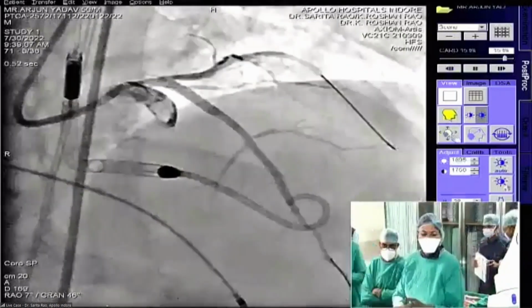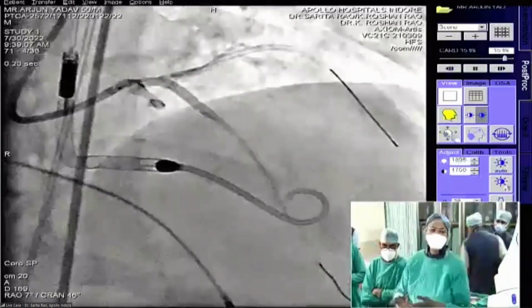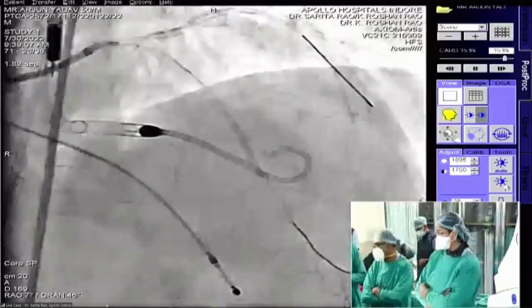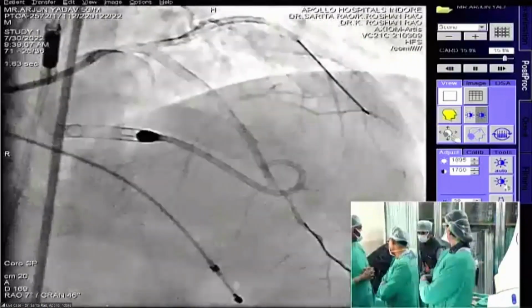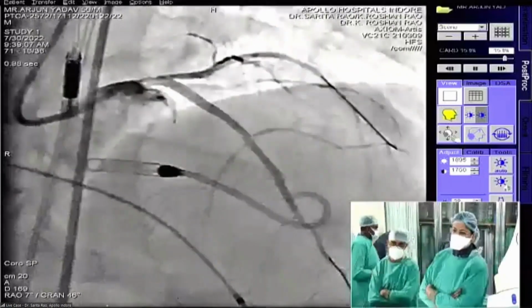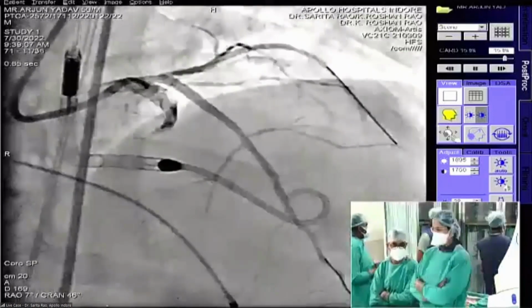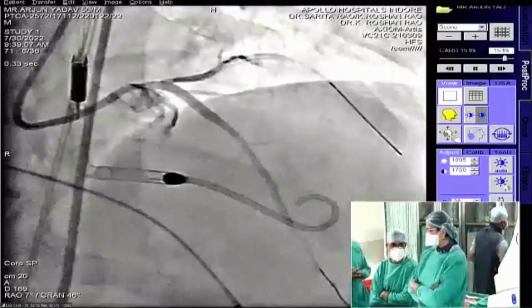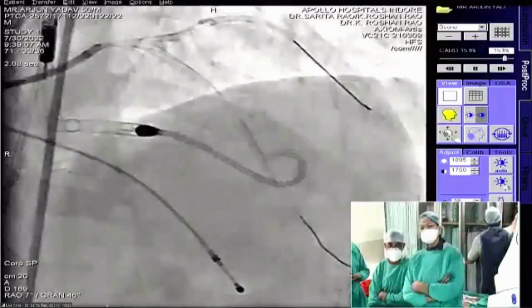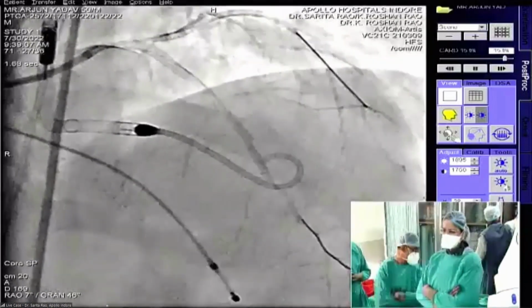Here, as you covered right from the ostium, I think you can be a little aggressive and take a little bigger balloon also and dilate it well. Because the LAD area looks bigger, and then the left main area, even angiography-wise, if not by OCT. On OCT also, I felt the left main area is still slightly underexpanded. You can attempt taking one more bigger size balloon and do part of the left main.